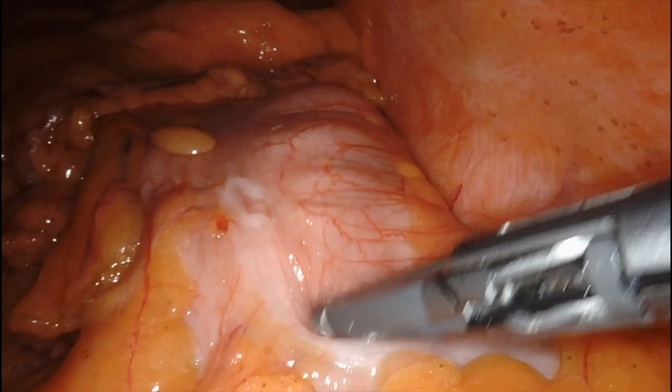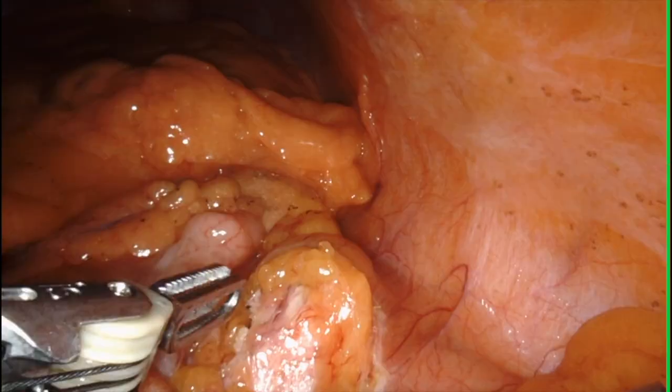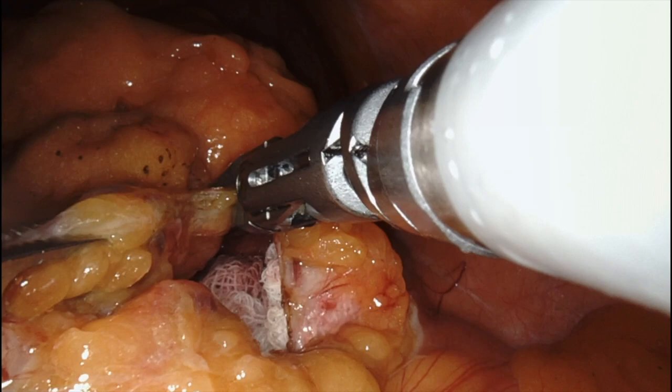Now I start to work laterally. I incise Toldt's fascia and work my dissection a little deeper in order to find the sponge that I left — only to signal that I have reached the right plane and that I'm not going into the retroperitoneum.